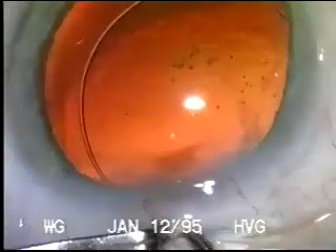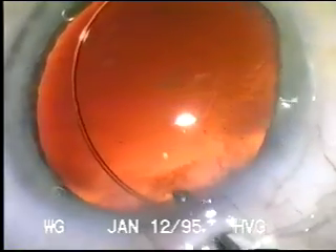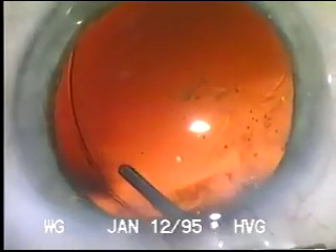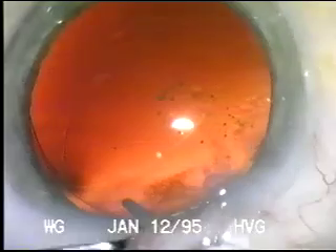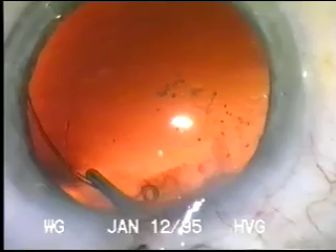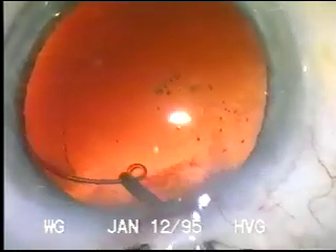You can see here that the advancing end of the loop is pushing in the area of weakened zonules. But this is ideal, because the tension of the capsule is then against the normal zonules and we do not compromise the area of weakened zonules.